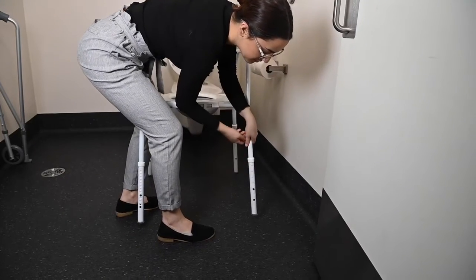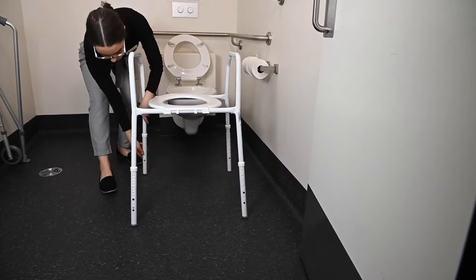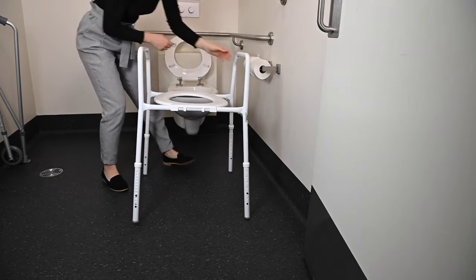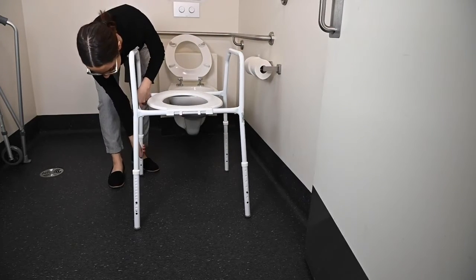Some over toilet frames may have one leg that has double the amount of holes. This is to cater for any slopes or uneven surfaces around your toilet. The frame should feel steady and shouldn't wobble once placed over the toilet. Continue to adjust until you find the correct height.